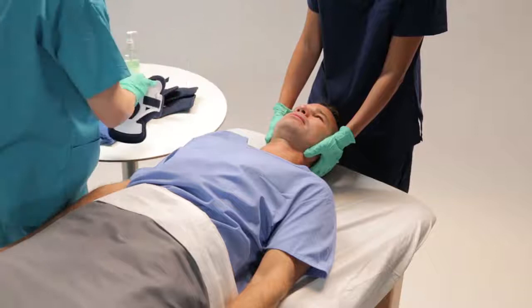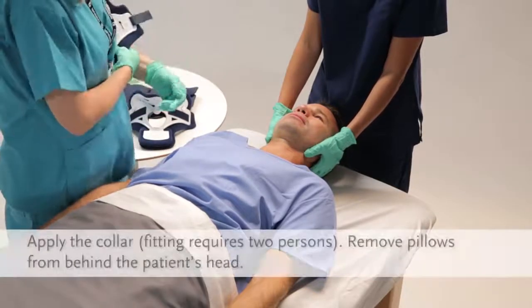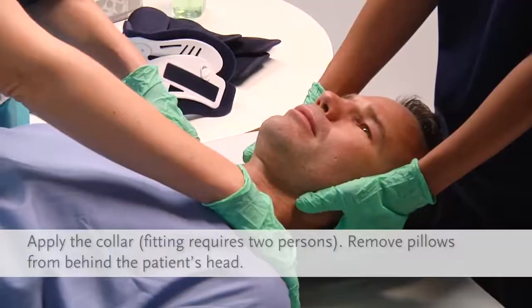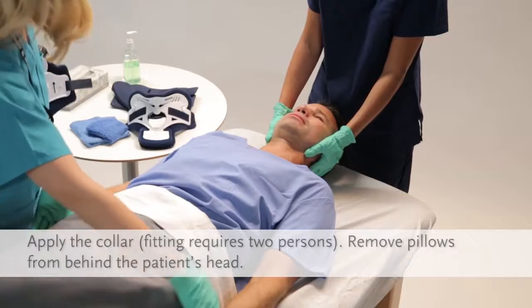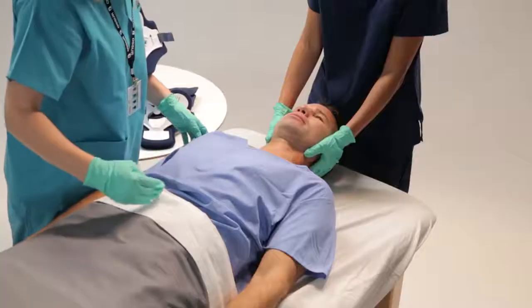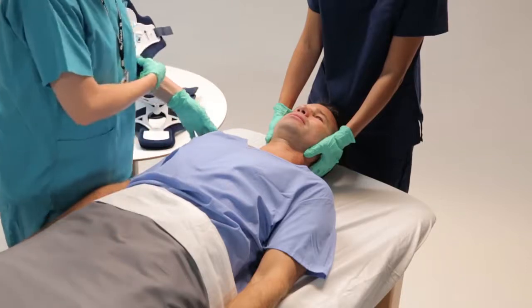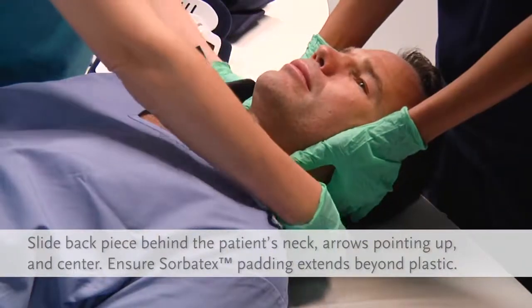Now that you have chosen the correct size, it's time to apply the collar. At least two persons are needed for initial collar placement — one to maintain the patient's head and neck in proper alignment, the second to fit the collar. Remove any pillows from behind the patient's head. Position the patient with arms to the side, shoulders down, and head centrally aligned.